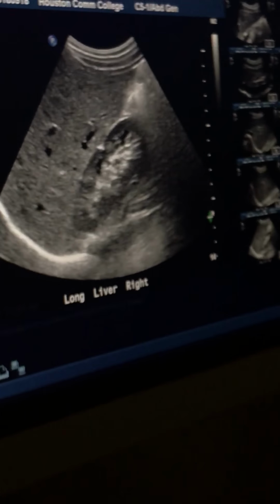Okay, so I'm going to do that again. So think of where her clavicle is, mid clavicle. Under her ribs is about here. I'm going to come to the very edge where I'm almost going to slide off of her, because that's where the kidney and liver should be. Deep breath and hold it. So it's there. Now I just have to fix it.